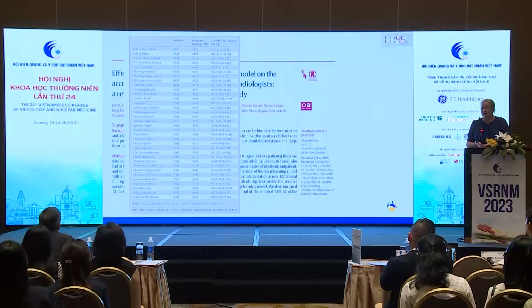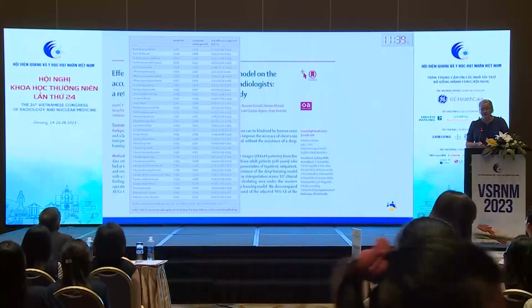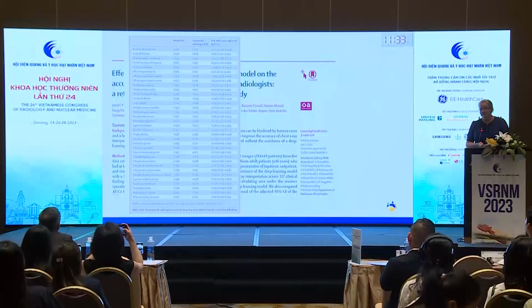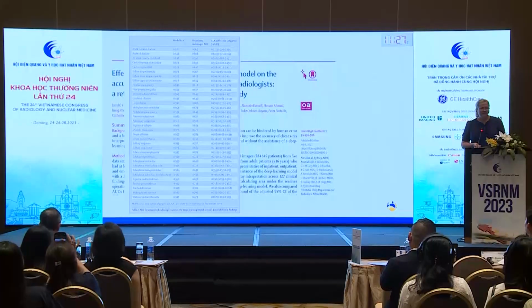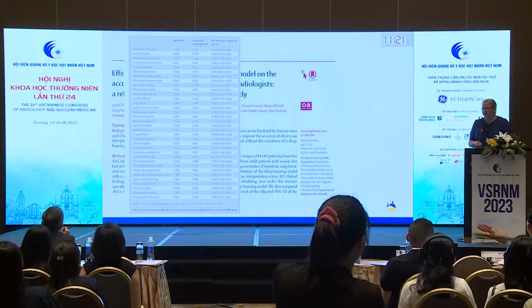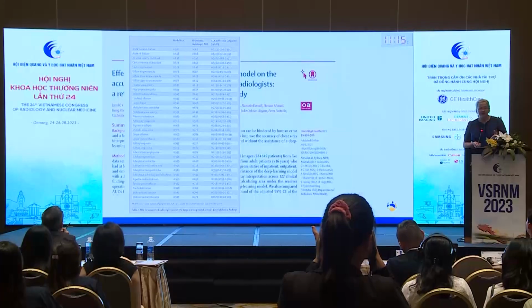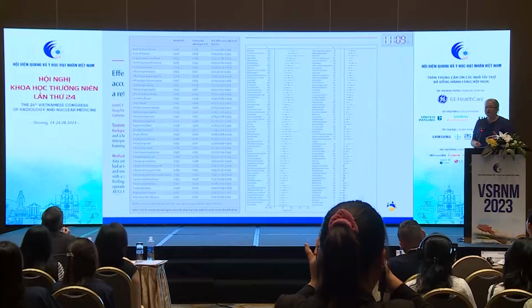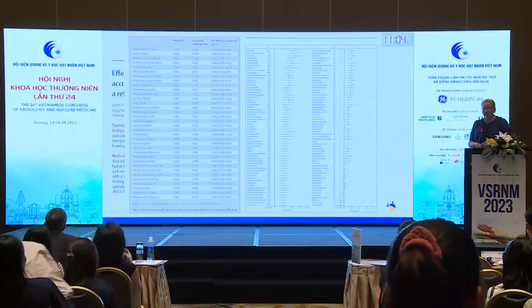It demonstrates that the AI, compared to the radiologist, is better at detecting the findings for most of these urgent findings compared to the radiologist alone. But of course, the radiologist has access to the previous history, why the patient's presented, the clinical context. So the radiologist uses all of those things. So what we do is we say, let's look to see how the AI affects the radiologist's performance. And that's where we bring in this kind of evidence to say that the radiologist's performance significantly improves when we have access to the AI.